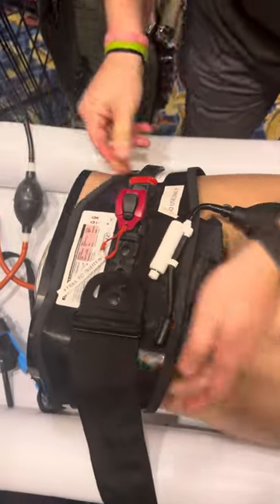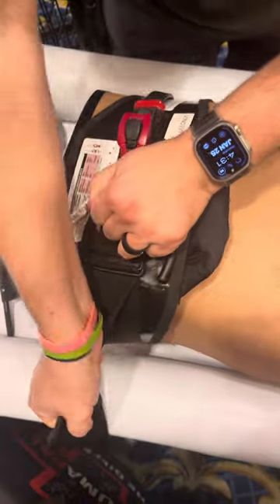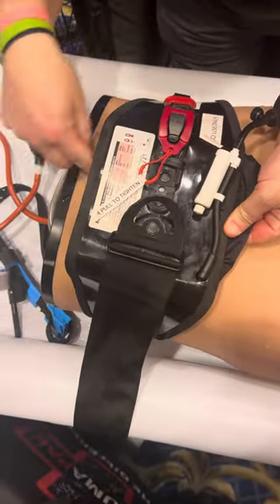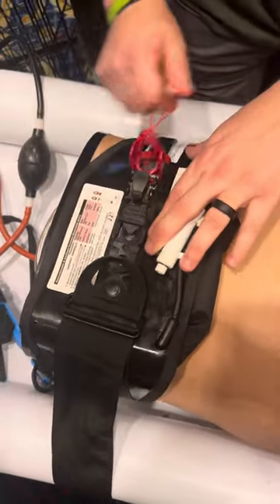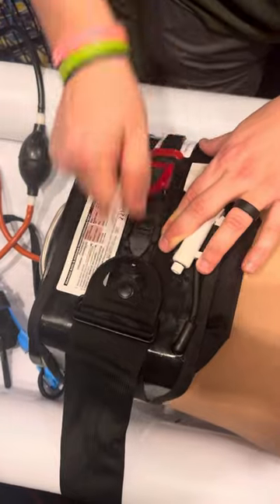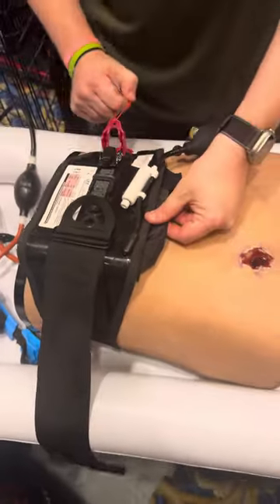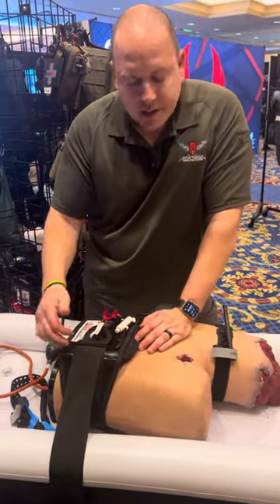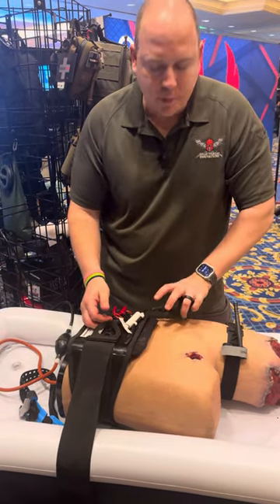I'm taking up all that excess strap — pulling on this, taking the excess strap, pulling that through. It's oriented in the middle. I went red to red. I'm going to take up all the slack that's left so it's nice and snug. We're not really tightening it with this, we're just keeping it nice and snug. If you were to use this as a pelvic binder, that is really all you would be doing — just taking it up with maybe a little bit of pressure.